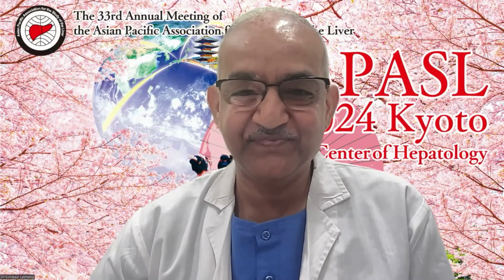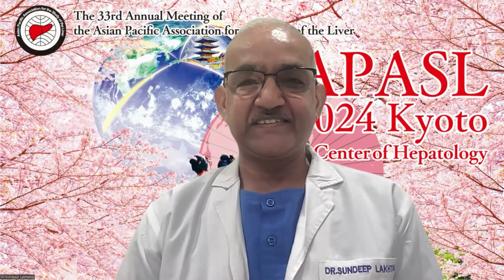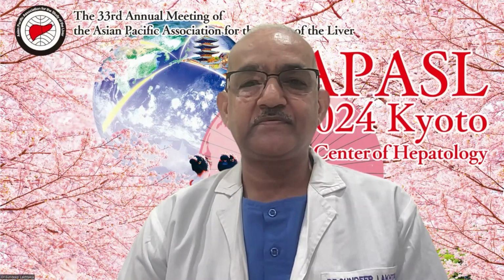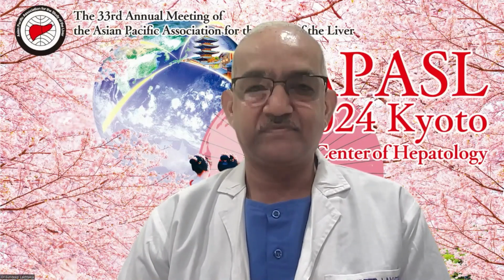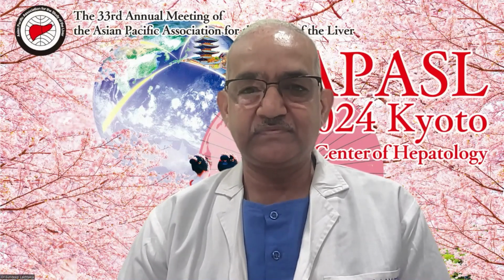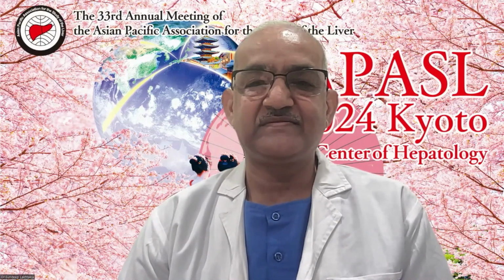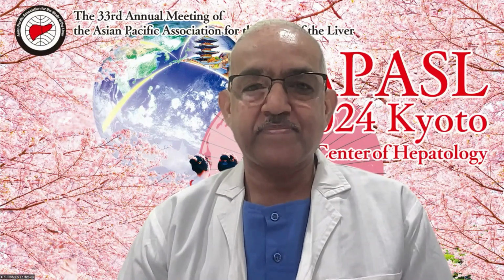Okay, I have one more question. We know that coils are quite costly, quite expensive. So can we block at the feeding vessel instead of the large vessel? Then can we save a little more money? In your practice, do you try to look for the feeding vessel all the time, and are you able to see them? If you see them, do you block only them, or go to the big gastric varices also? Thank you.